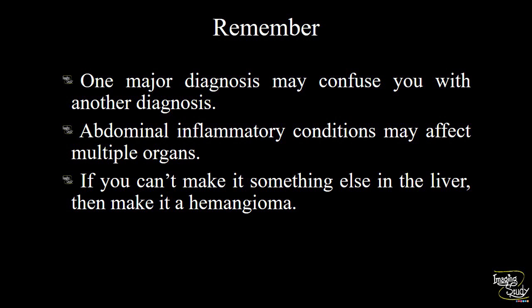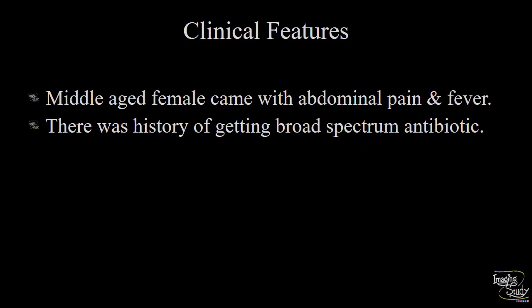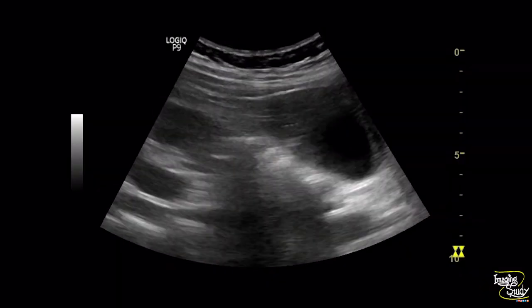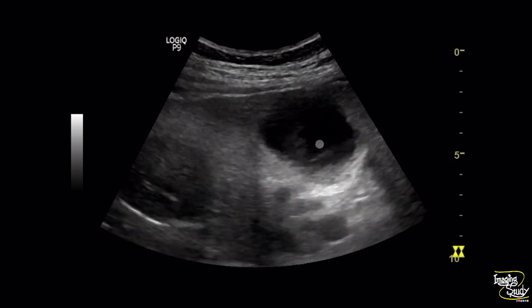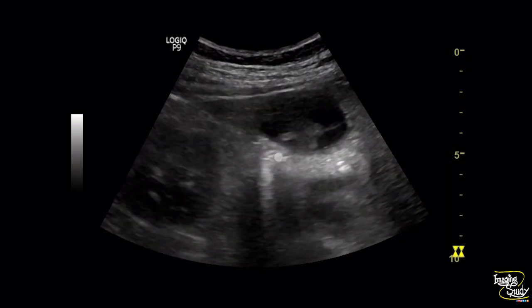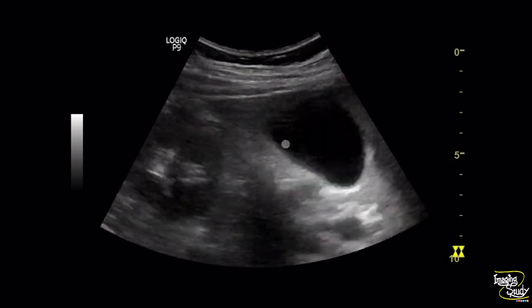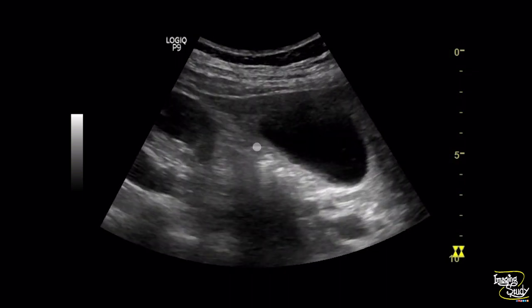Case number three — this will be a fairly easy case. A Middle Eastern female patient came with abdominal pain and fever. The patient was admitted to hospital with a history of receiving broad-spectrum antibiotics. Here is the ultrasound of the gallbladder. You can see an irregular mass-like area within the gallbladder lumen which is hypoechoic, with some echogenic foci noted within it.